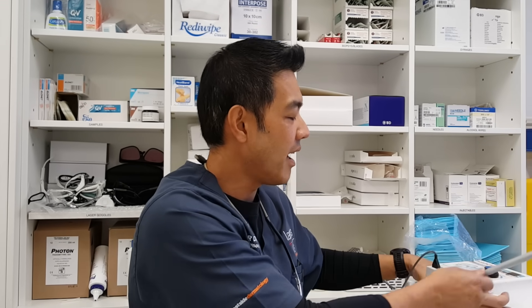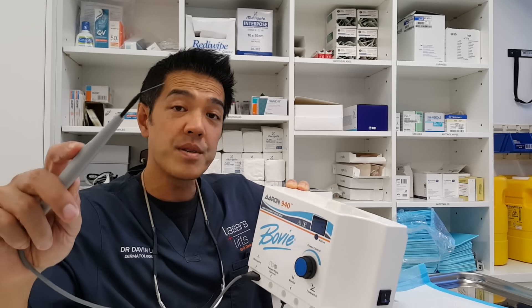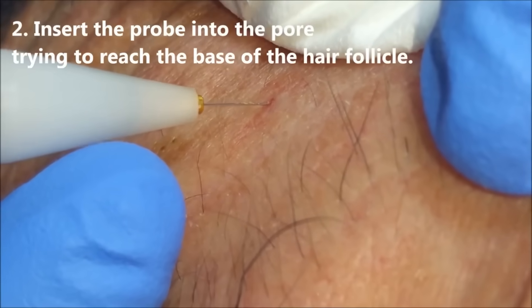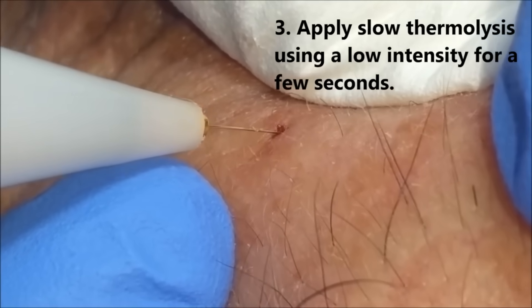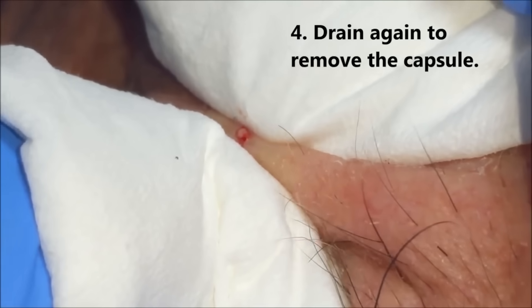Someone like Jessica Reiner would use a device called an electrolysis or hyfrecator. A simple extractor coupled with this electrolysis-type needle hyfrecator device can actually treat dilated pore Winers. She uses a needle method together with a hyfrecator to get results. Out of all our methods, she probably has the highest cure rate because she's using heat in the form of thermolysis — heating up the wall of the pore of Winer to actually ablate it, killing the actual cells. So she's not only draining the pore, but curing it in the vast majority of cases.